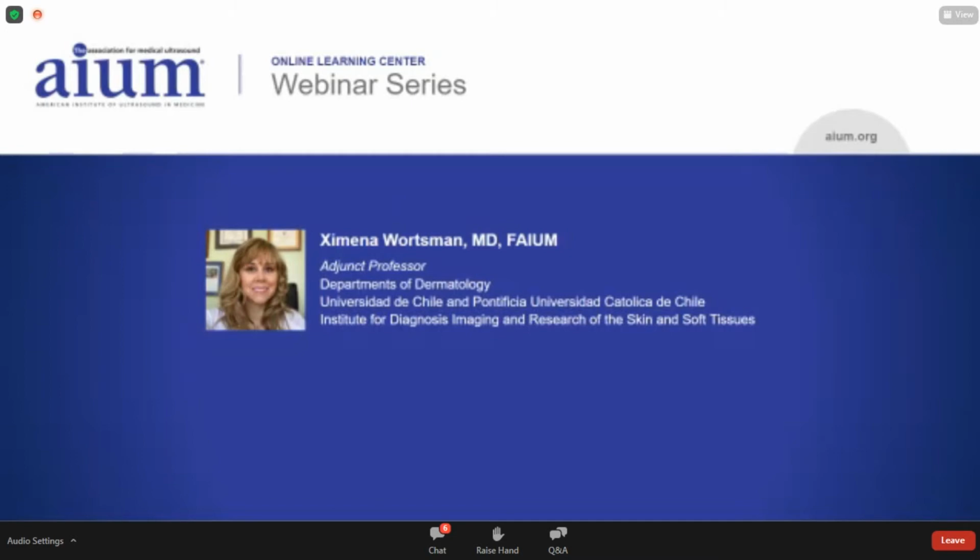You have some images that are not grayscale. That's the question. Yes, we use grayscale, color Doppler, power Doppler. We use all the tools of ultrasound in these studies.